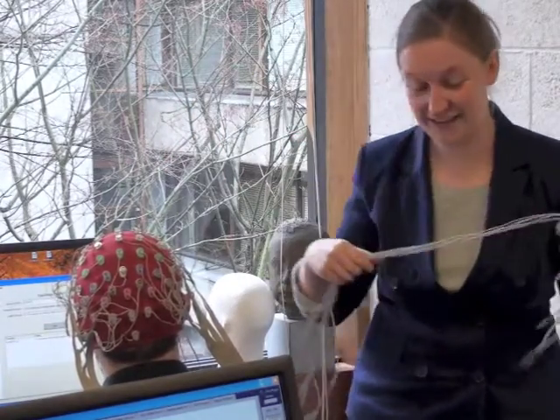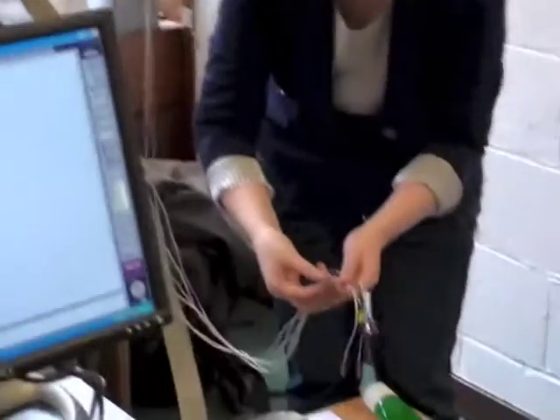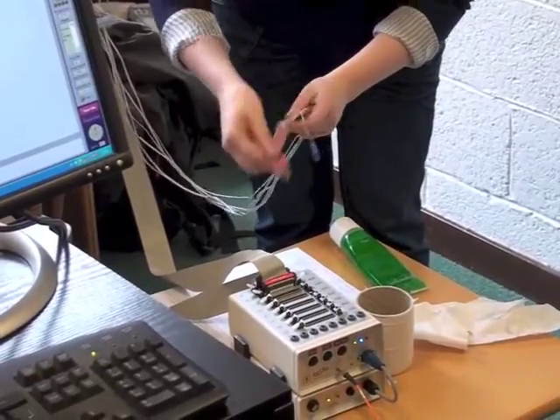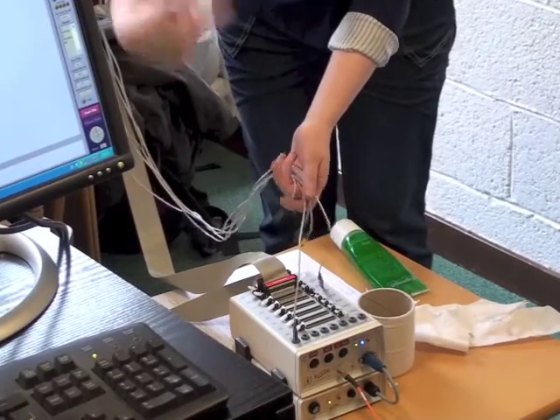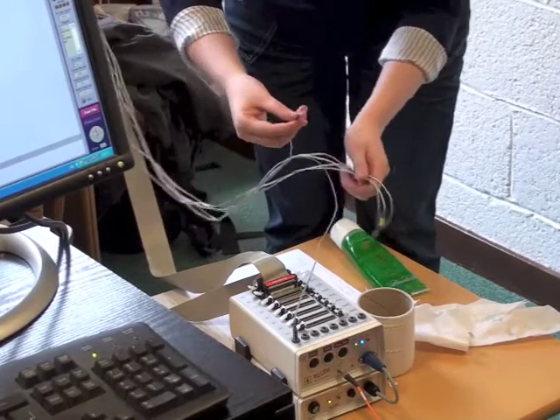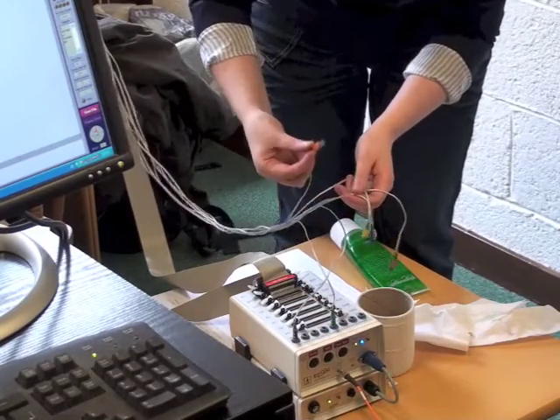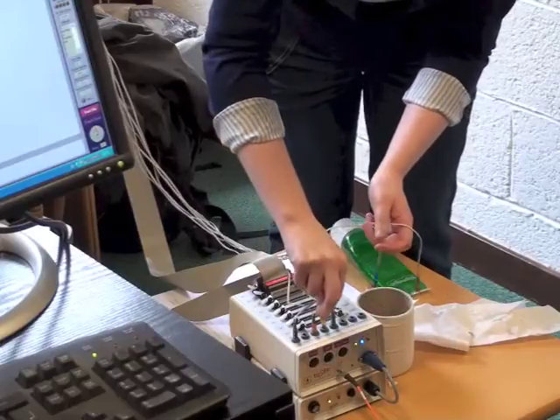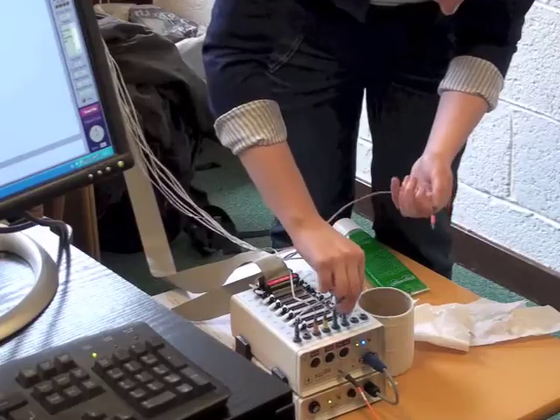Now, after you have these done, you just plug them in, and they're labelled EX1 to 8. I'm hoping the program is going to run properly, because I have the configuration set up for 64 plus 8, and I only have 64 plus 6 here, because the others are in a box. I could just get them if it doesn't work. But it should work, because if one of these was damaged or broken, it should still just ignore that one, EX6, but you never really know.